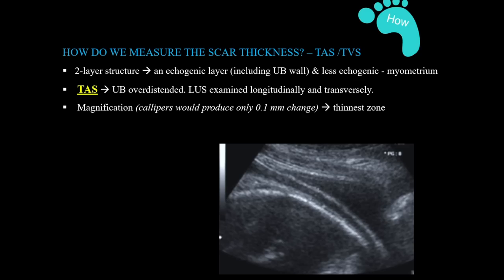There are two options for measuring the lower uterine segment scar: transabdominal or transvaginal scan. The lower segment scar thickness is a two-layered structure. Via the transabdominal approach, the bladder should be overdistended. A large view of the lower uterine segment in the midsagittal section is obtained, then the image is magnified to focus specifically on the lower uterine segment.